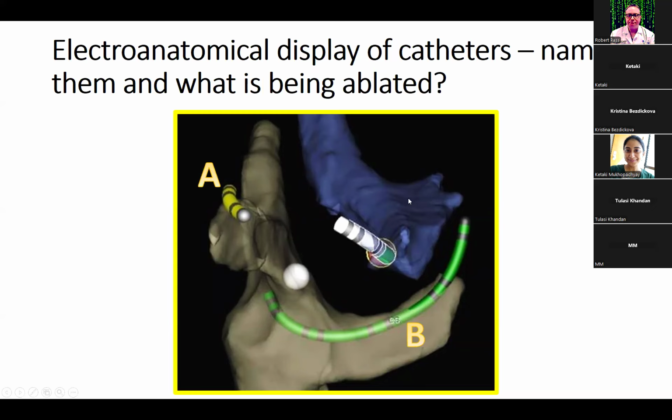We can do this, and we do this, but it's actually much easier to deflect the catheter down in this region. It sort of naturally falls here with relatively little movement and twisting on the catheter. To go in this direction is actually very challenging. And so now the good news is most pathways are around this area, in the area where it's relatively easier. So posterior to lateral or posterolateral is where I think the majority of left-sided pathways live.